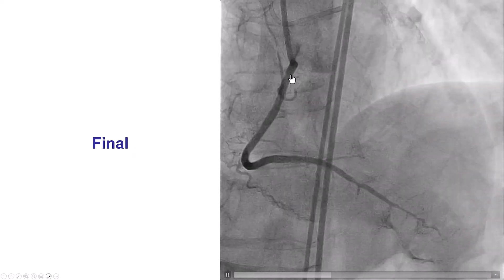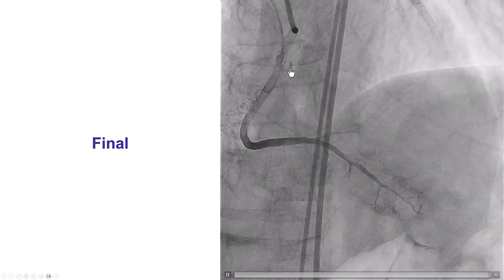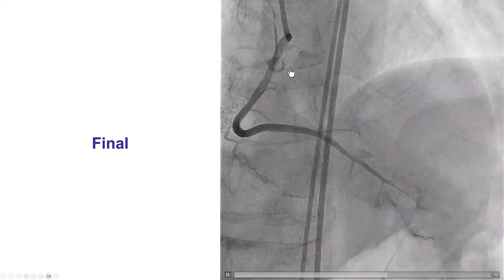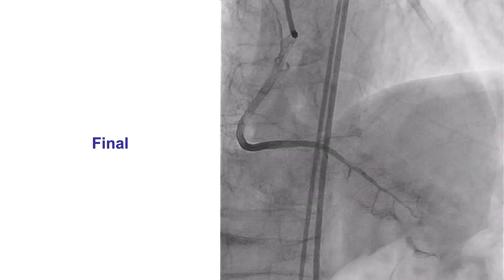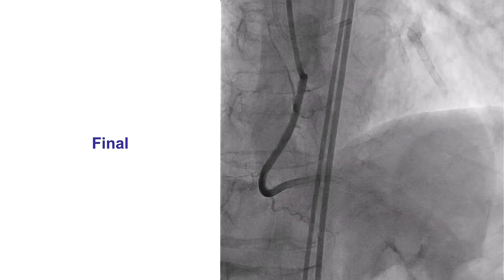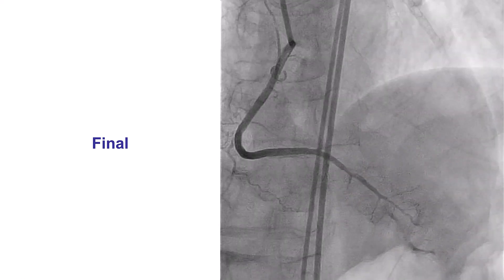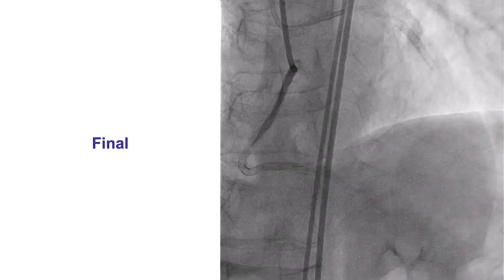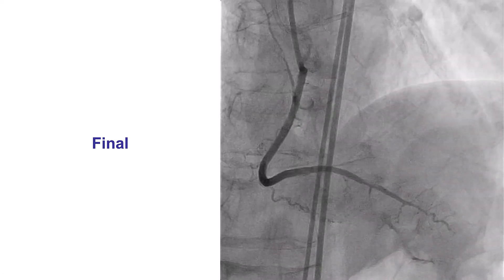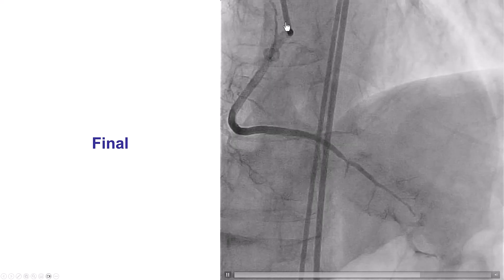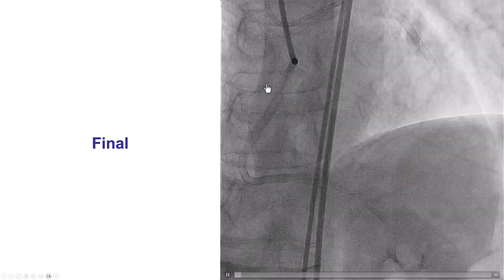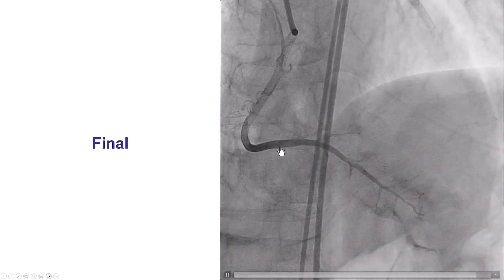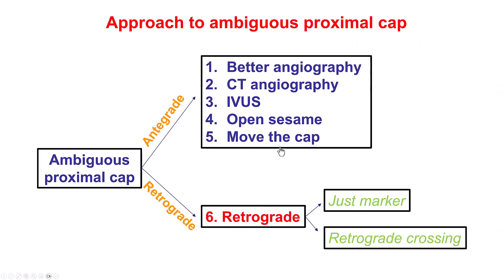Very important when we use the move-the-cap techniques is that we need to be able to re-enter. So having experience with the Stingray system and with dual-lumen microcatheters is important, because going extra-plaque is the first step and it requires getting back into the distal true lumen.